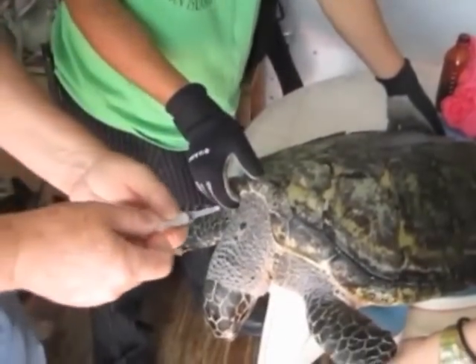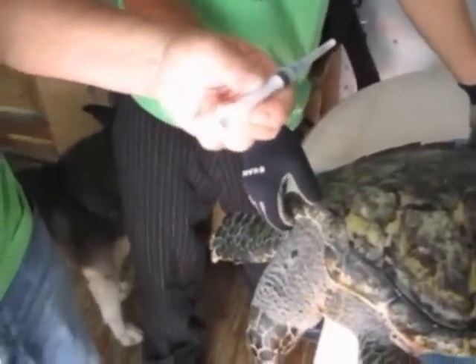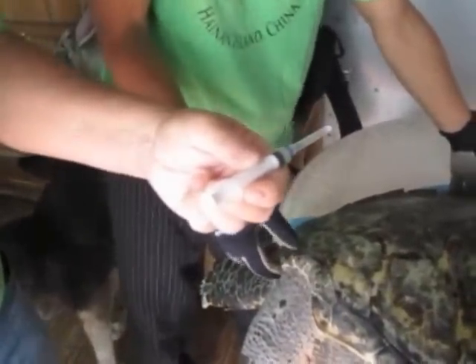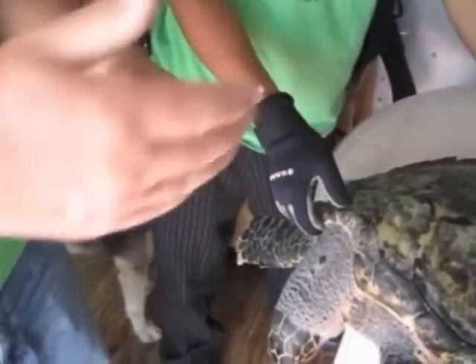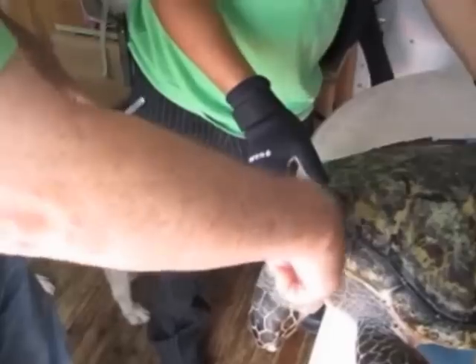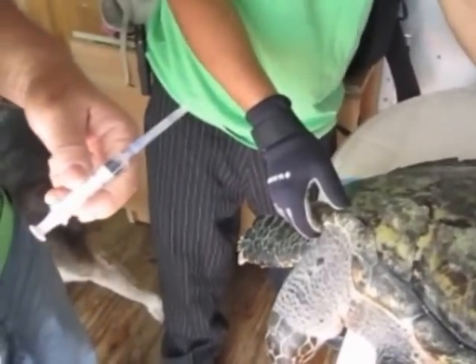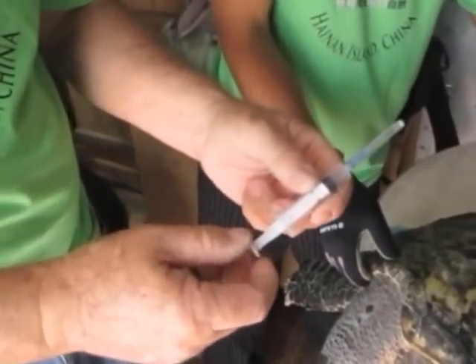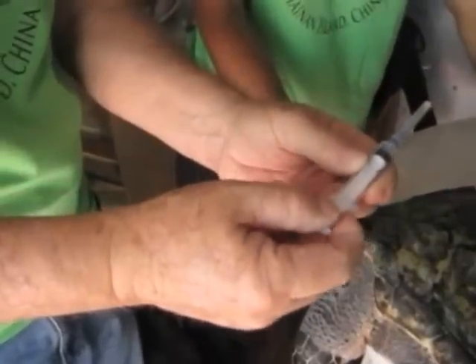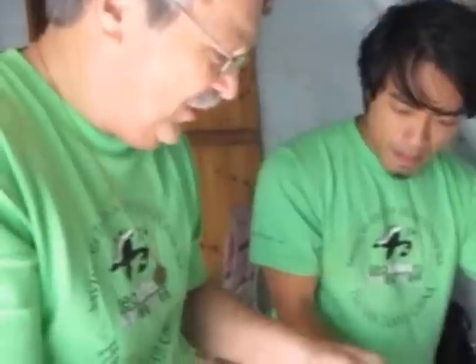Once you get the needle under the skin, you have to get some vacuum on it, so that often means a little bit of discomfort with your fingers because it's awkward how you're holding it. You get the needle in and then you start — you feel the vacuum is going to pull it out. It has to have vacuum in order to draw blood when it finally goes through the vessel where the blood is. Sometimes it can be quite deep, sometimes quite shallow, sometimes more up or more down, and sometimes you've got to stick the turtle several times to get the spot. A little health warning: when you first put the needle in, there should be no space in there, because if there was, that means there's air in there. When you go in, you might inject air into the turtle, and you don't want to be doing that — it would give it an embolism if it was in a vessel.